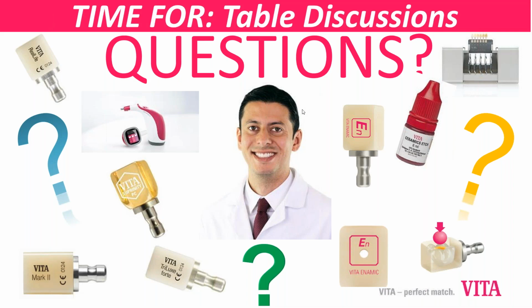We have to work on making the adhesive cementation quicker and more streamlined as well. But if the clinical situation makes it too difficult, conventional cementation would be the best way to go, and that's also a great possibility with this material.